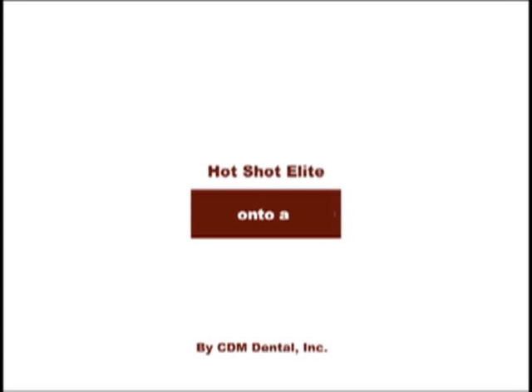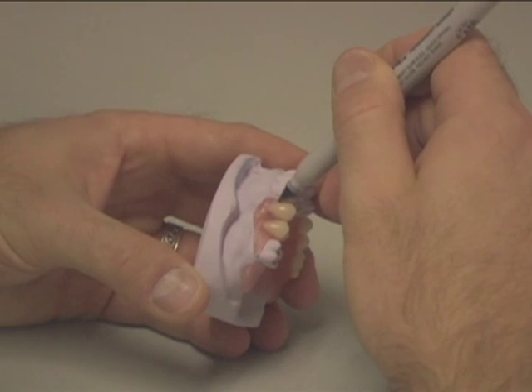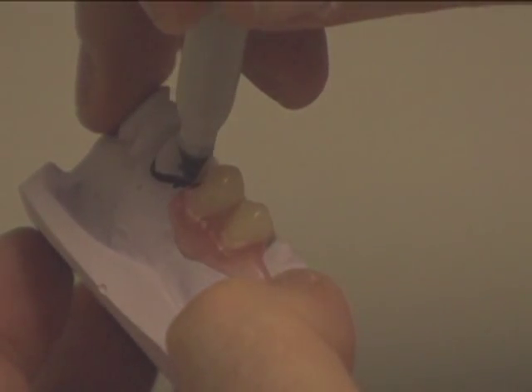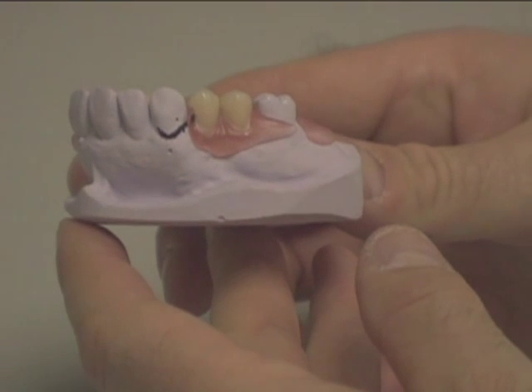Duracetyl clasps onto a nylon partial. Mark the mold indicating where you want the clasp to be on the tooth. Most of the time you can place the clasp at the cervical of the tooth.